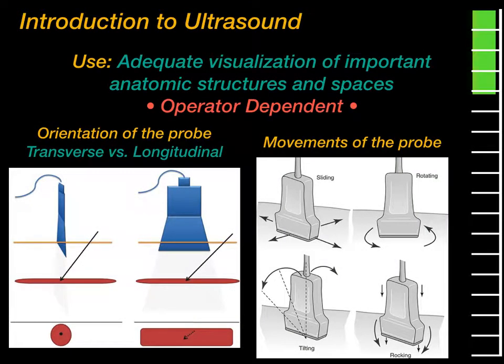Ultimately, the use of ultrasound becomes relatively operator dependent. However, the adequate visualization of important anatomic structures and spaces come with practice. The orientation of the probe can either be in a transverse or longitudinal plane.